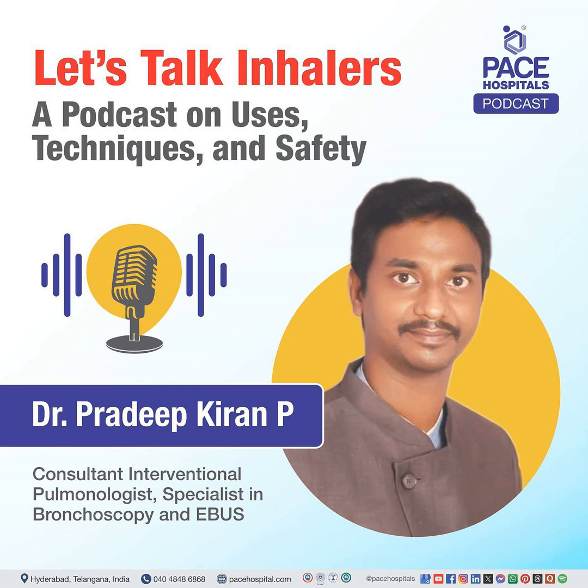Now, how to use it? This is a meter dose inhaler. Before starting, as you can see here, there's a space. You have to connect like this. This is how you prepare your inhaler with spacer. You have to place the inhaler at the space given here. So now your spacer is ready with the device. The second step is, this is your mouthpiece. You have to keep it inside your mouth. So once you keep it, then press your inhaler. As you can see, a mist will come, that is the drug, and settles in the spacer device. It will be stored.